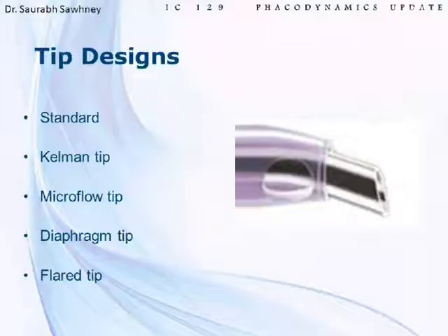And secondly and critically, this bend is instrumental for allowing you to use a torsional phacoemulsification, as will be discussed later. Torsional is a whole new way of delivering energy, and it can only be done if you are using a Kelman tip. You cannot do that with a straight tip. So this is a design for a Kelman tip.